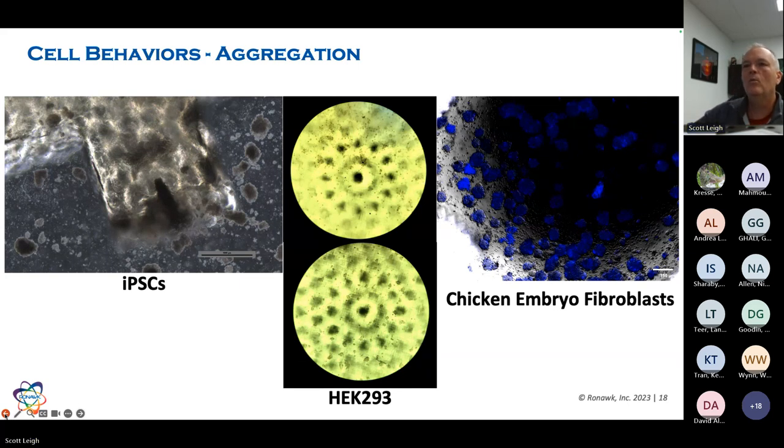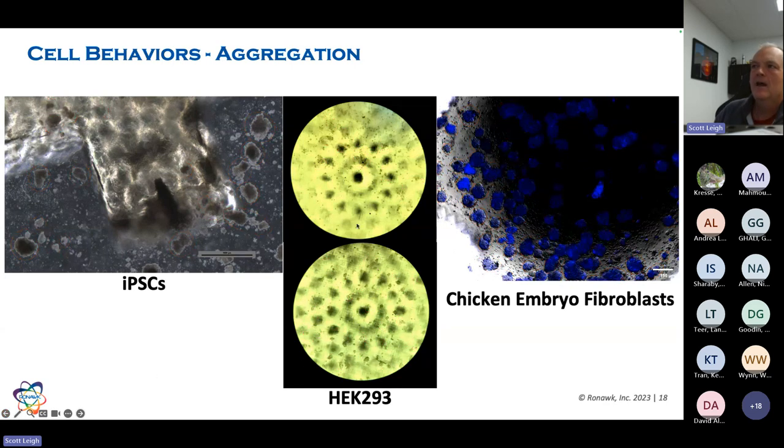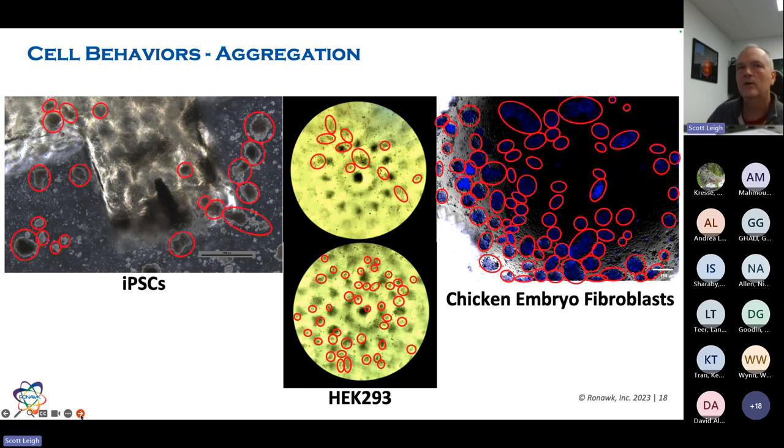So then, what about more production size cells? What you see in the middle, HEK293, is one of your top five production cells used in the world. This is taken strictly on an inverted scope, and what you see, all those aggregates forming on the block. This kind of spiral looking thing in the middle, I'm gonna go back here for a second, remove these. These are the pores and channels in the block. And then you see all the dots.